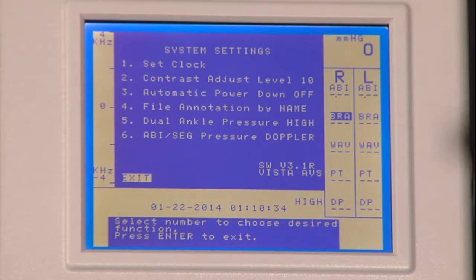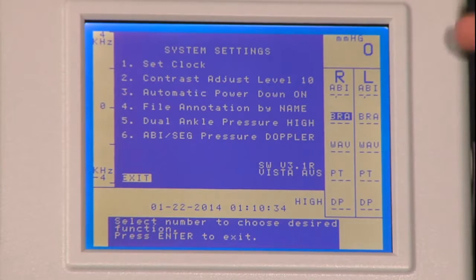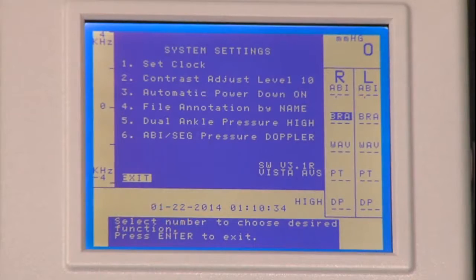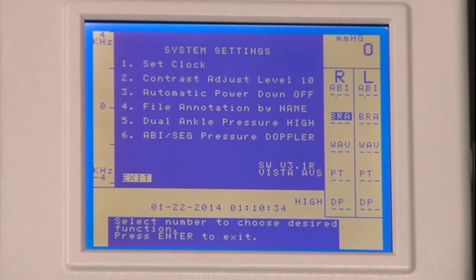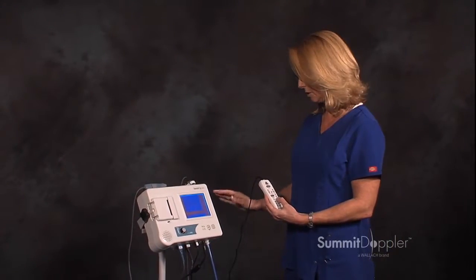Pressing number three for automatic power down — currently off. Pressing number three again to choose on. This tells the unit that if you want it to automatically power down after no use for 20 minutes, you would have that on. Or pressing number three to turn that off means the system would need to be manually turned off.